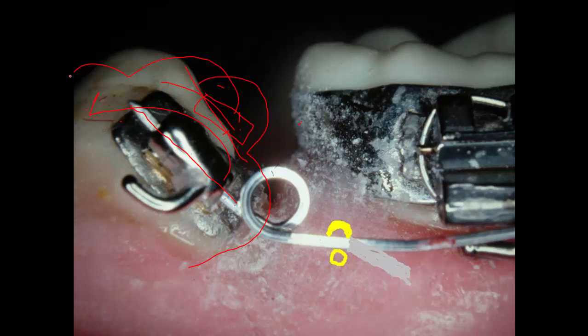You don't even have to have the person in braces. Actually, if somebody comes in with a tooth tilted over like that, you can just bond a wire on about 3 or 4 teeth over here and mark this off and come in and put your little hook, and you can upright a tooth without any braces on it at all. You just need this one little tube that goes in this area right there when you go to do it.